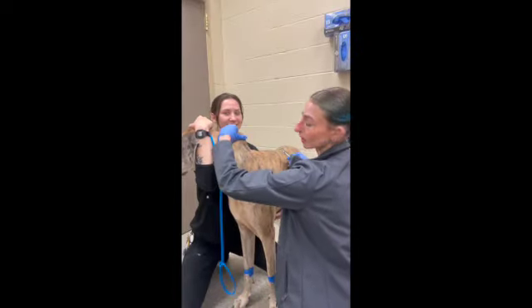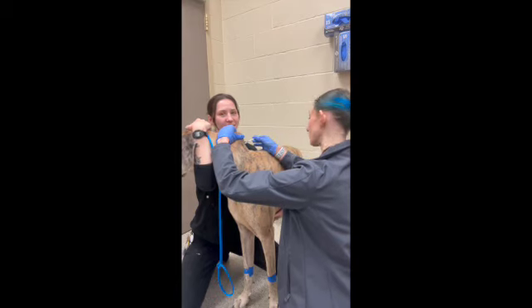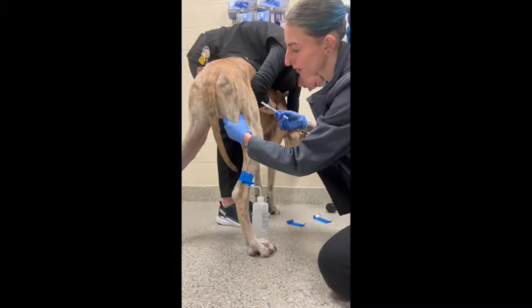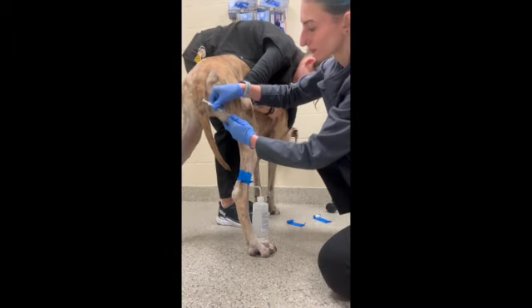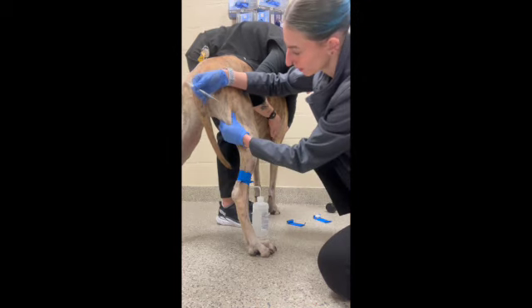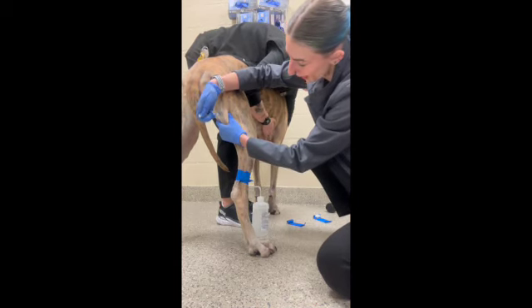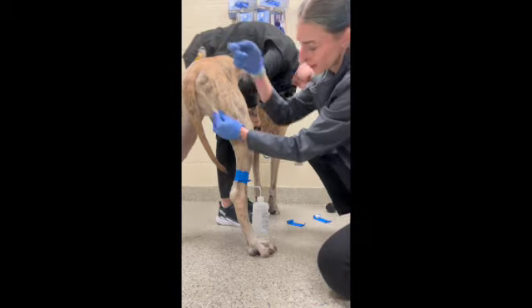Alright, you're going to tent the skin up like this, and in the tent, you're going to insert your needle and draw back to make sure that there is no blood, and inject. We're going to find our nice meaty spot. Alright, you're going to inject it, and then pull back on your syringe to make sure that there is no blood, and then go ahead and inject.